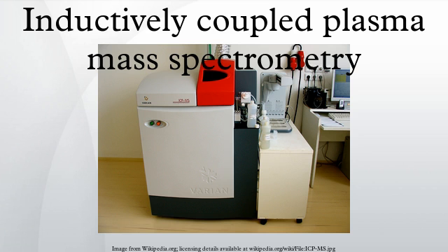Sample preparation. For most clinical methods using ICP-MS, there is a relatively simple and quick sample prep process. The main component of the sample is an internal standard, which also serves as the diluent. This internal standard consists primarily of deionized water, with nitric or hydrochloric acid, and indium and/or gallium. Depending on the sample type, usually 5 ml of the internal standard is added to a test tube along with 500 microliters of sample. This mixture is then vortexed for several seconds or until mixed well and then loaded onto the auto-sampler tray.